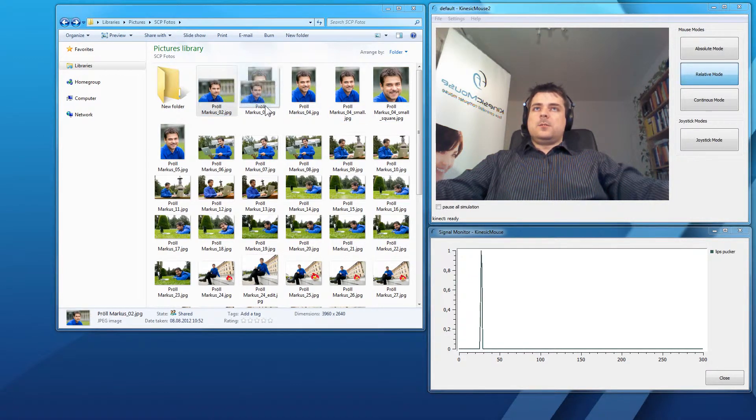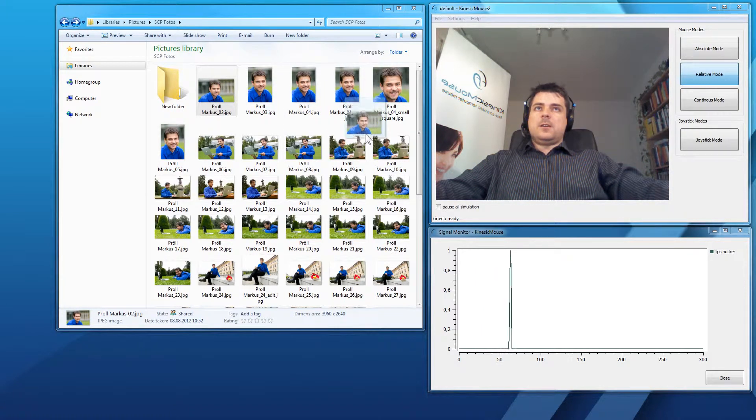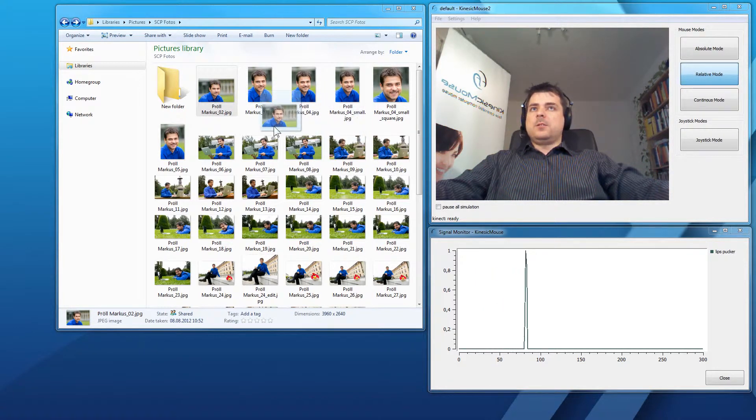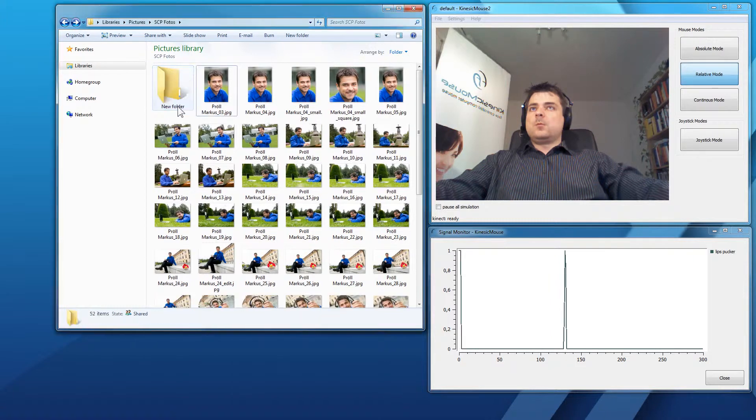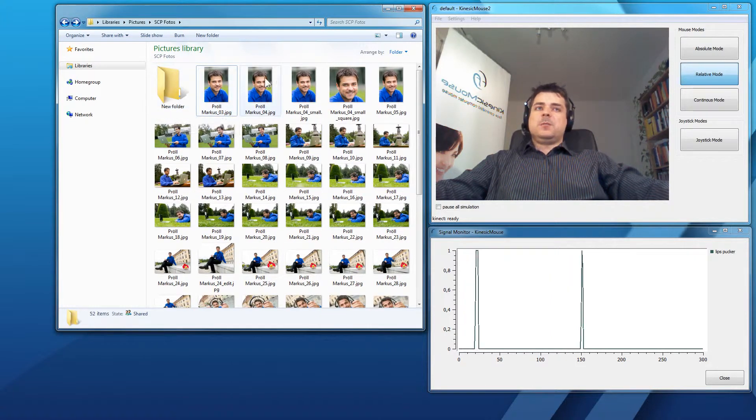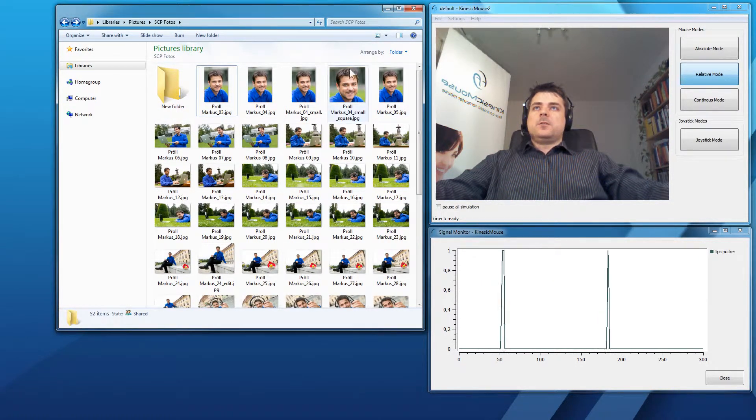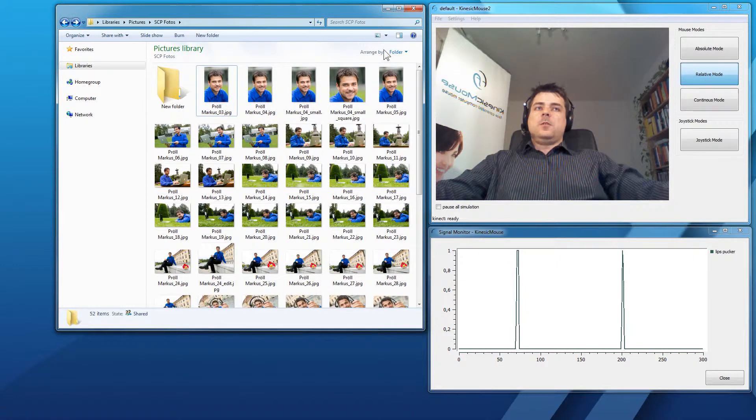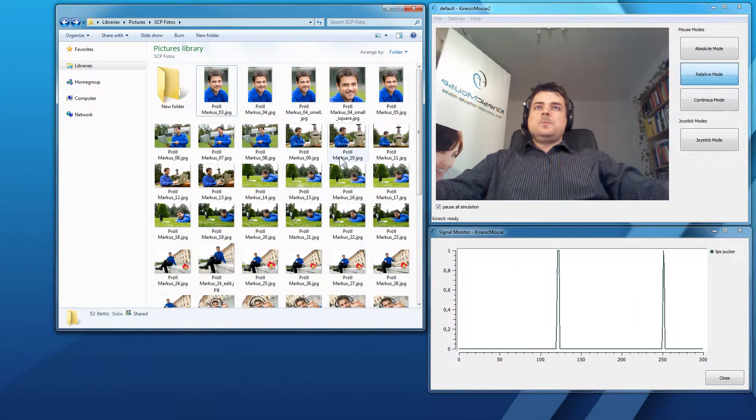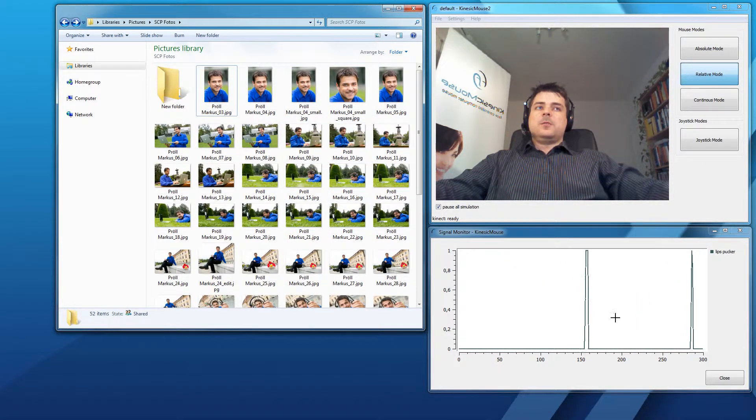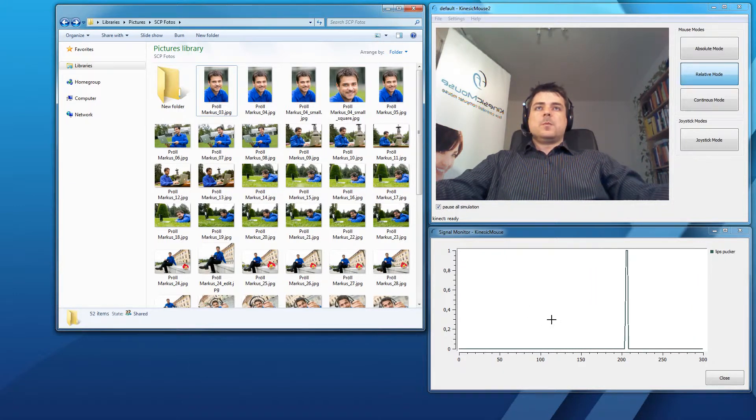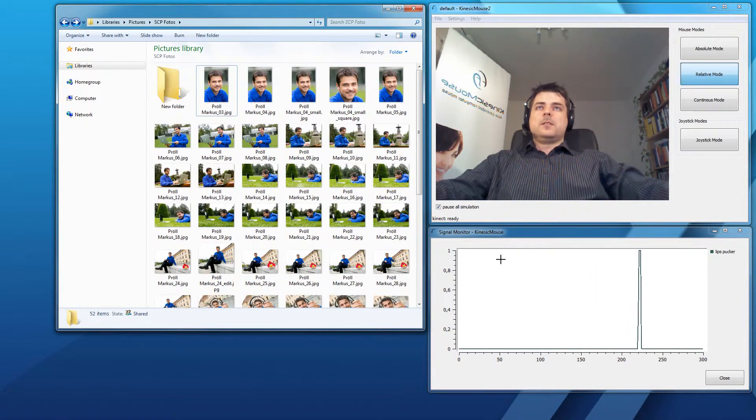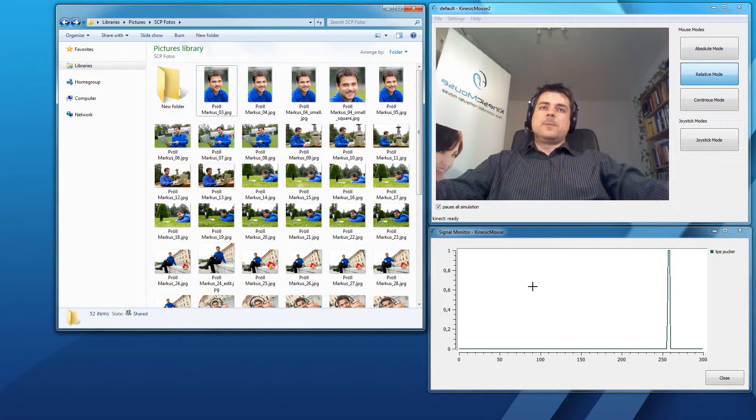So, right now I have selected the item and I will go to the new folder and perform the lips pucking again and it is dropped into the folder. So, you've seen the difference. I have to make this signal twice to click and drag.